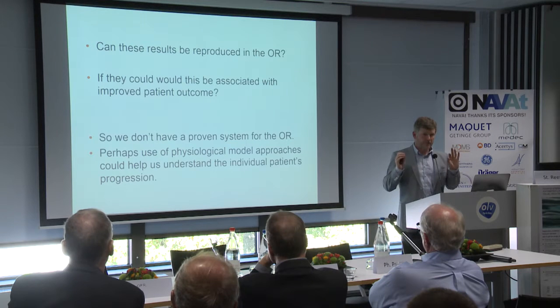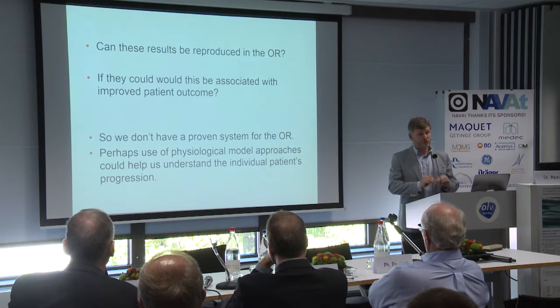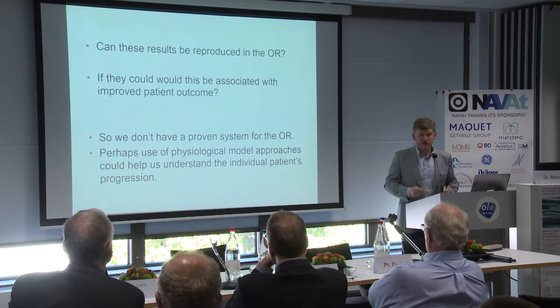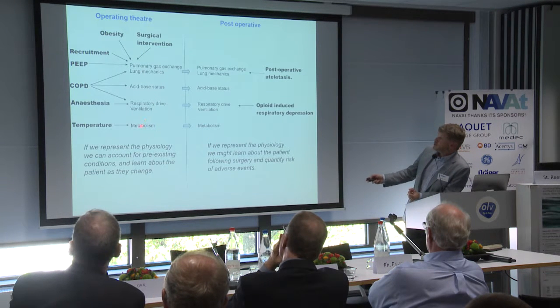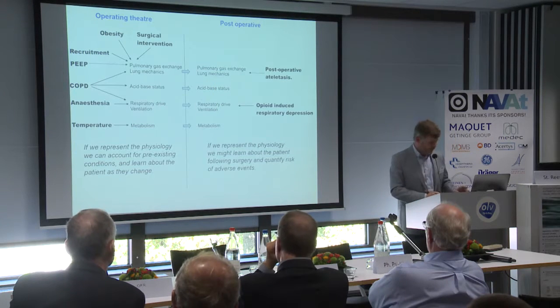We don't have a proven system in the OR, but here comes my speculation again. Perhaps if we began to monitor on a deeper physiological progression and had some continuity of monitoring between the phases, then we'd be able to study these things more easily. Back to this picture of, if we could measure these things routinely and transfer them to the postoperative phase.